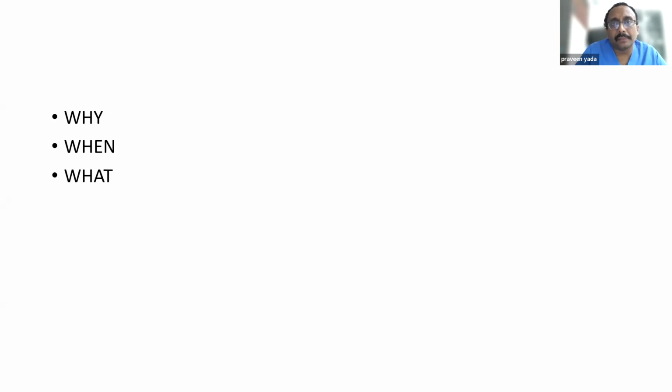Always keep in mind, when a nerve conduction is given in the exam, flip it, look at the SNAPs. SNAPs are reduced, your life is easy, because this is a simple neuropathy. SNAPs are normal, then the problem arises. Okay.